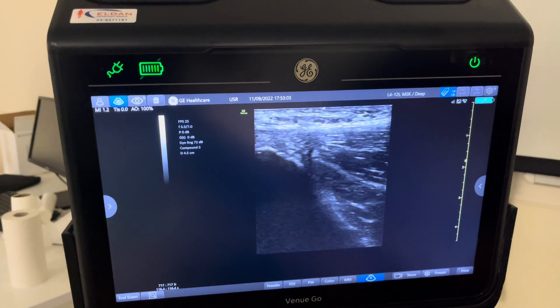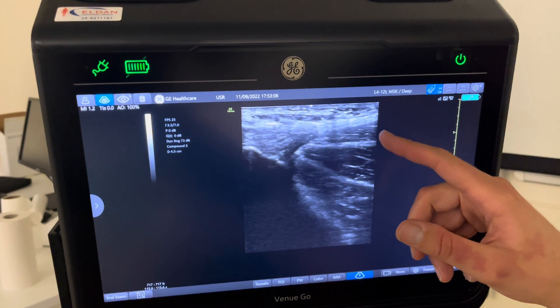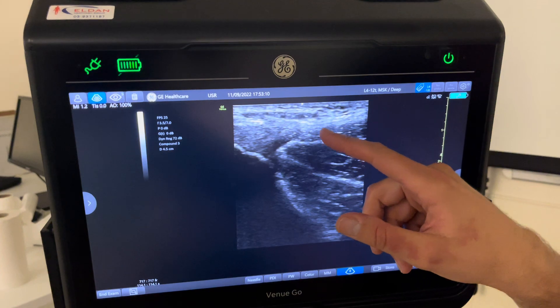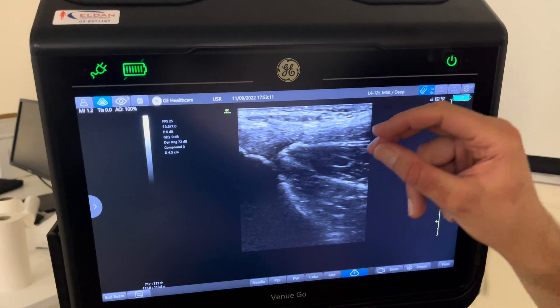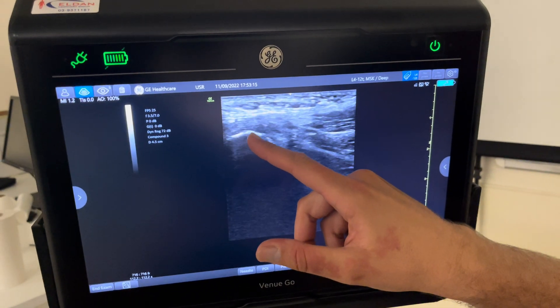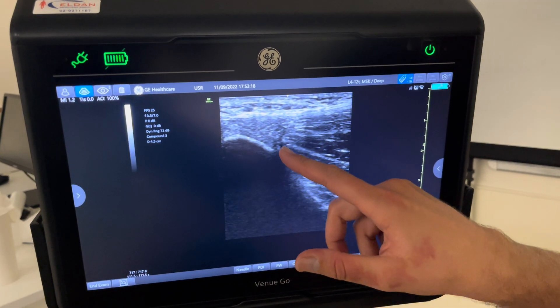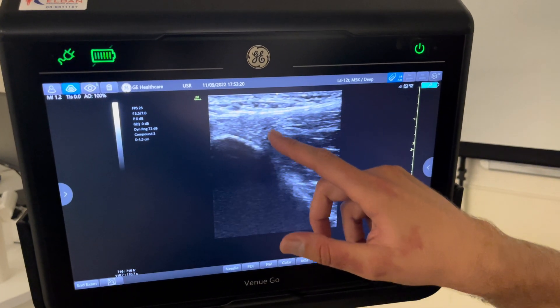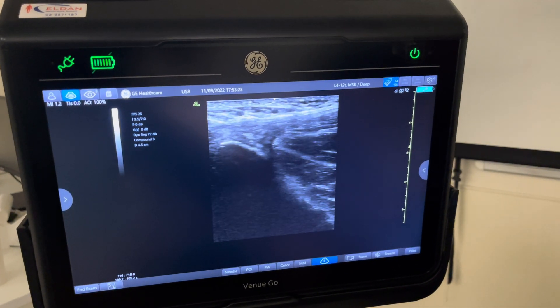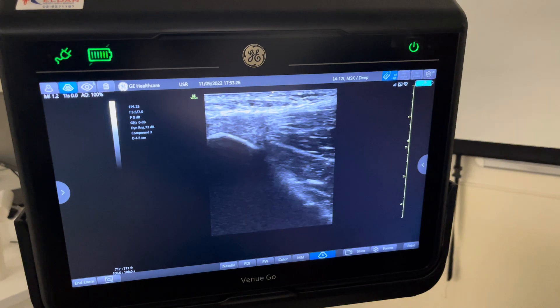Beautiful — now we have a very nice picture. This is the top layer of the tendon; the deep layer does a bit like this, it becomes a bit wider near its attachment. The bone here looks very regular, no irregularities. The tendon looks pretty much the same brightness, doesn't look thickened — so this looks like a very normal adductor tendon in this case.